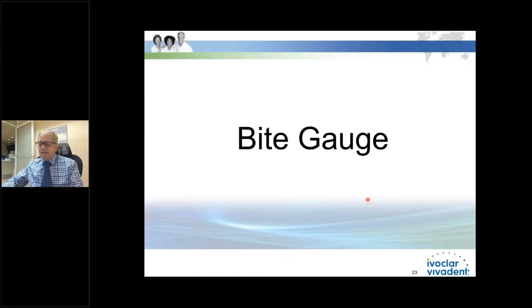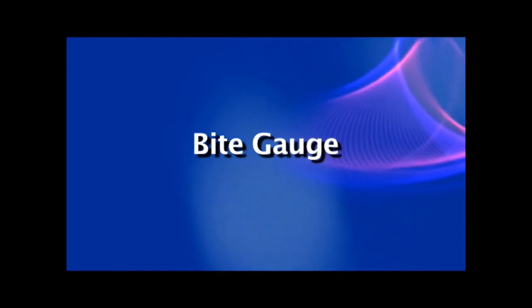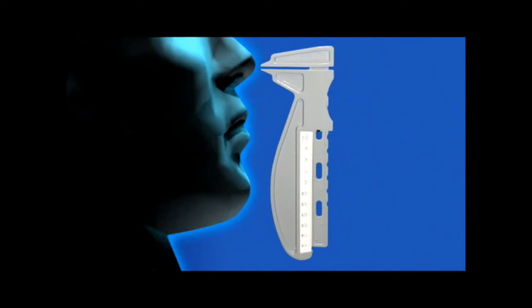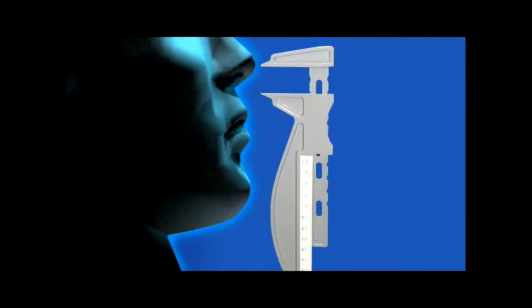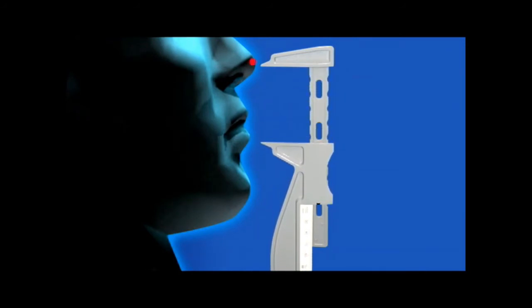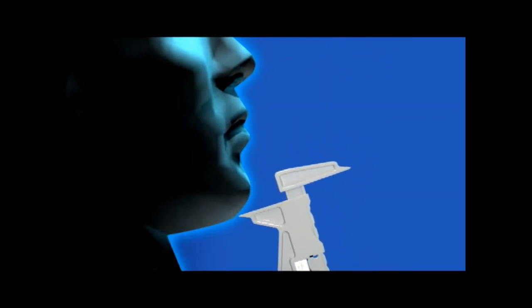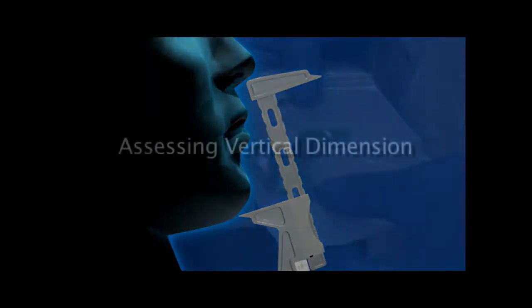This next one is a bite gauge. The bite gauge is a convenient tool that helps to measure the facial vertical dimension of a patient. The gauge can be used in two ways. It can measure from reference points placed on the patient's nose and chin, or it can be used without reference indicators by reversing the bite gauge so that one arm rests under the patient's chin while the other arm is elevated to rest under the patient's nose.